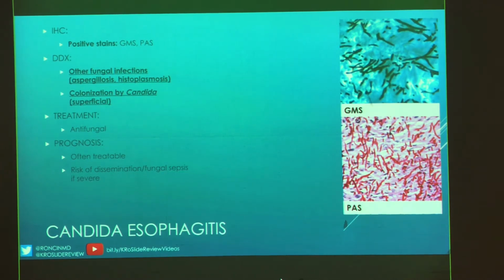You'd want to think of different fungal infections, so aspergillosis and histoplasmosis. With the fungal infections, also think about what's common in whatever area of the world you're in. And you can also have colonization by Candida, and this would be very superficial, so you wouldn't have the very verbose, florid reaction that we saw in that case.